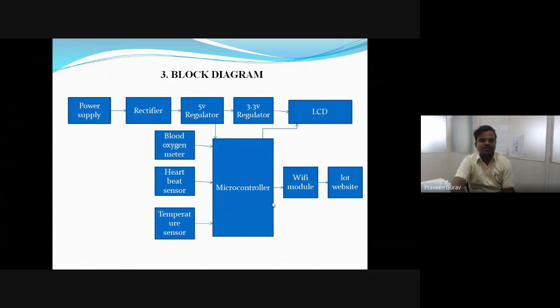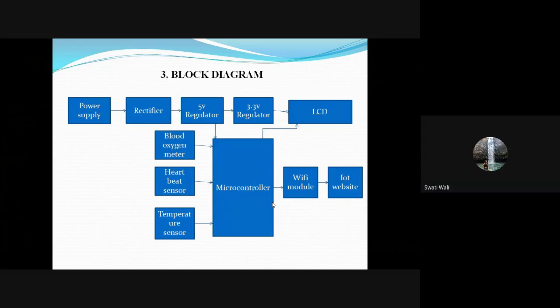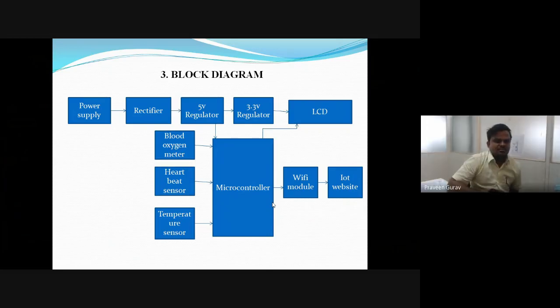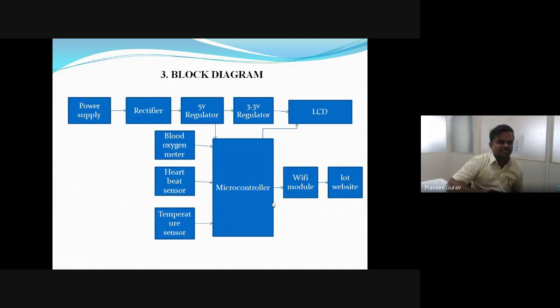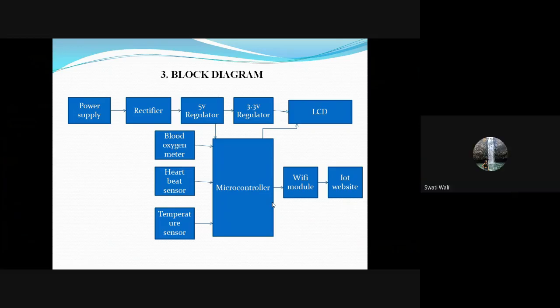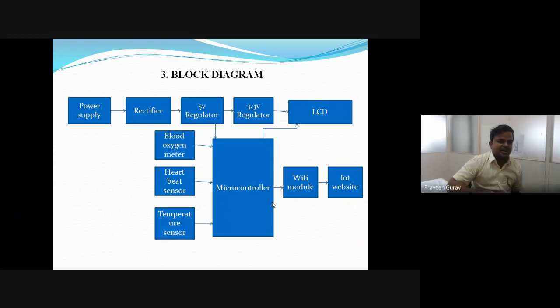Can you say something about the heartbeat sensor? How does it work? What is the working principle of this heartbeat sensor? Swati, the question is over to you only. Yes, sir. Heartbeat sensor means it will check the heartbeat pulse, how the heart is pumping the blood. That is true, the heartbeat sensor has to sense the heartbeat. But my question is how it works, on what principle it works.